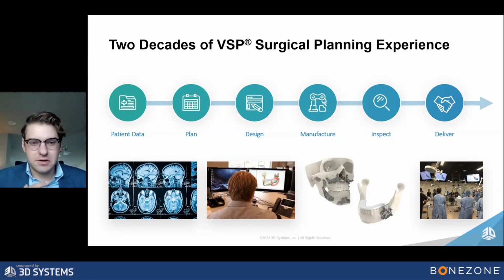With personalized medical devices, inspection becomes incredibly critical because your lot size can be thought of as N of 1. So we go through generally 100% verification on all the patient-specific parts that we're going through, as well as fit checks and interfacing with standard components to make sure that this patient-specific device is going to behave as intended.